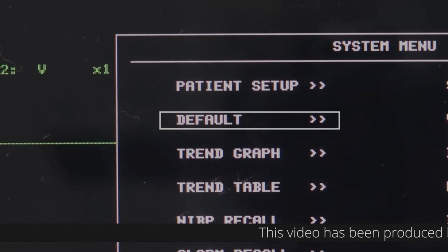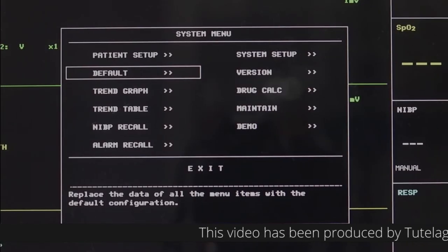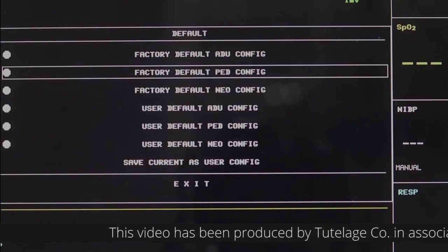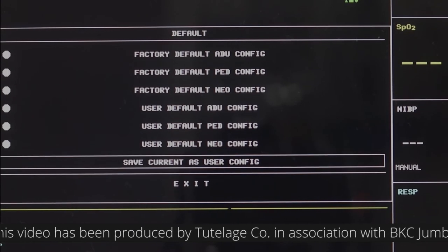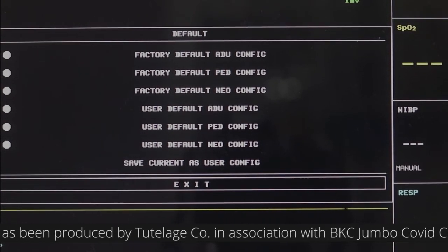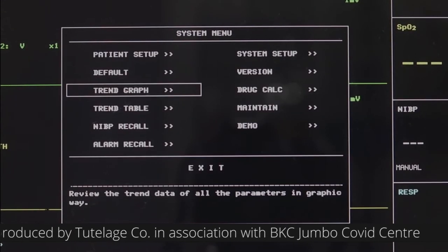Default Setup: There are two types of default configurations, factory and user defined. You can also save the current system configuration as the user defined configuration. Click on exit to return to the system menu dialog box.